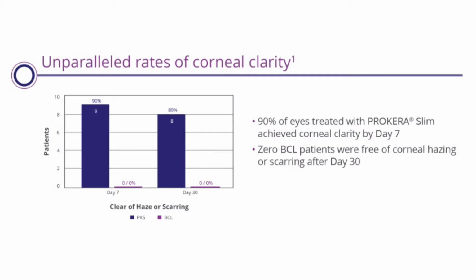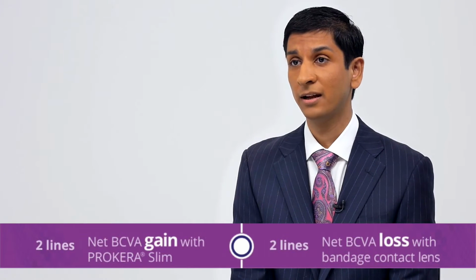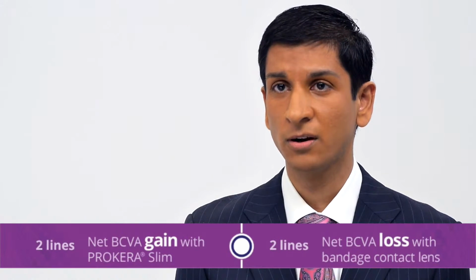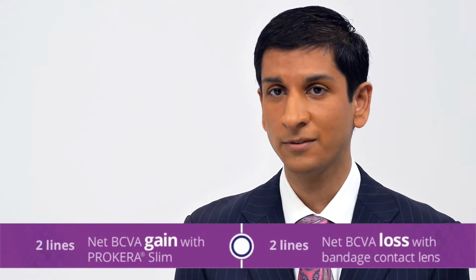As a group, the bandage contact lens eyes lost 2 lines of best corrected visual acuity, proving that that haze and scar was clinically significant and visually significant. And the PROKERA eyes as a group gained 2 lines of visual acuity. So the quality of healing was significantly better.